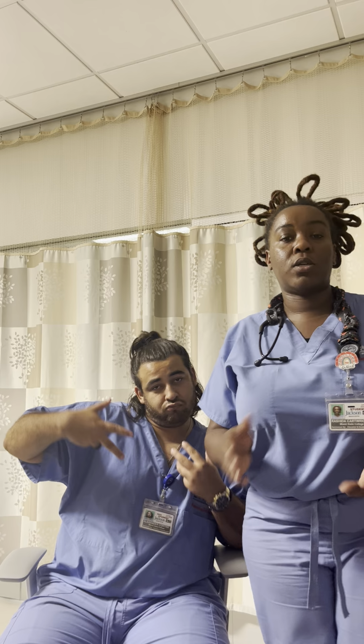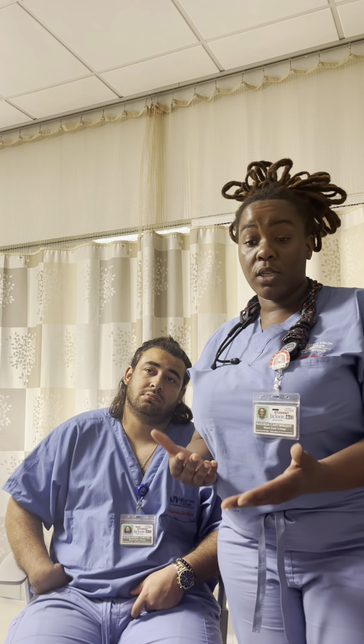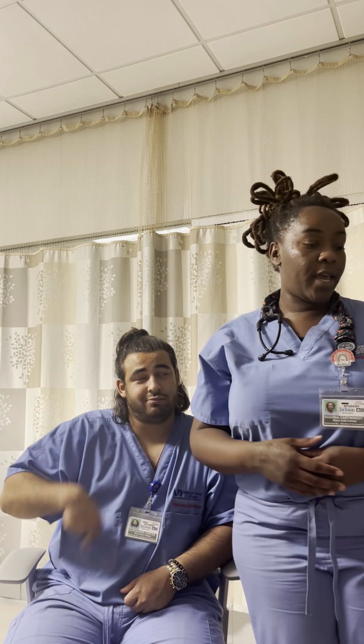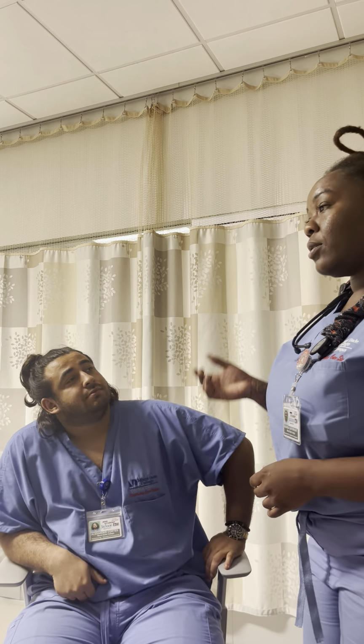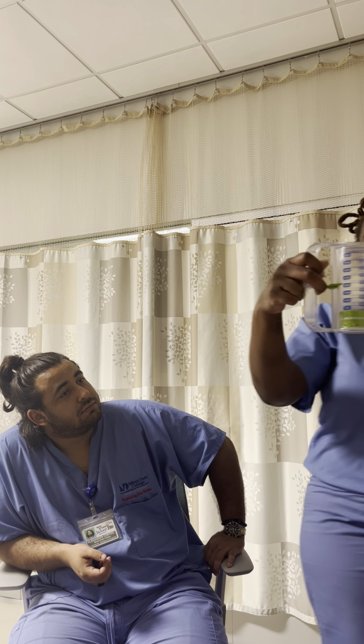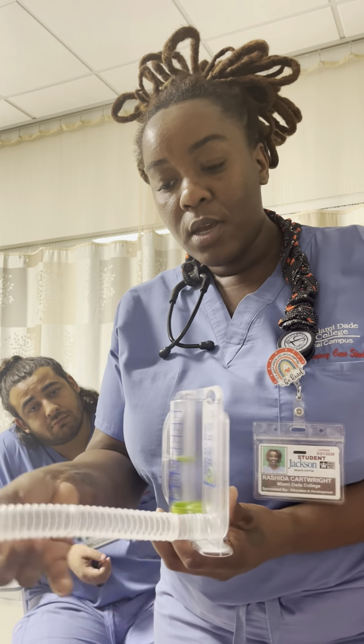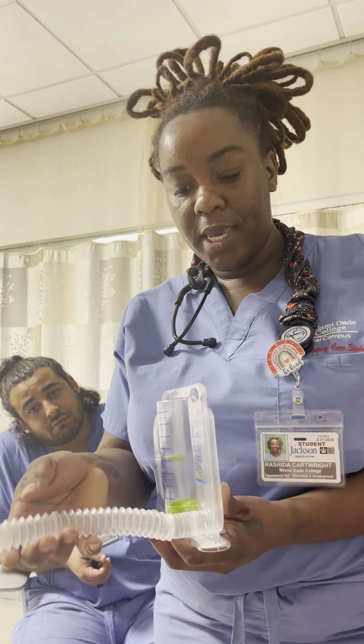So first, I'm going to start off by verifying my orders. So I'm going to look at the chart. Okay, we're doing IS spirometry today. After I look at the chart, I would assemble my equipment, which is the spirometer here, and we got the tube here for the mouthpiece.